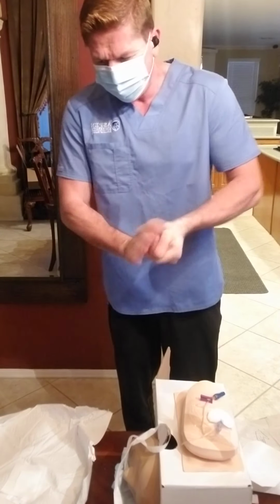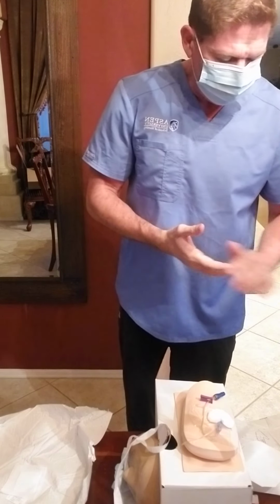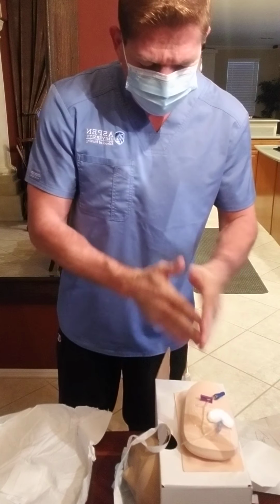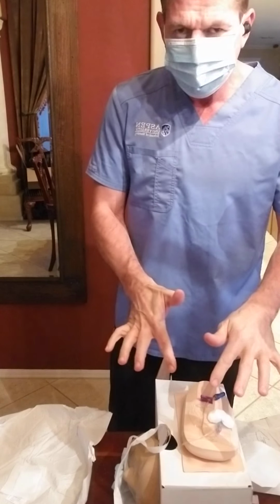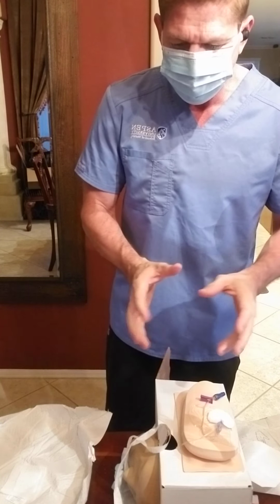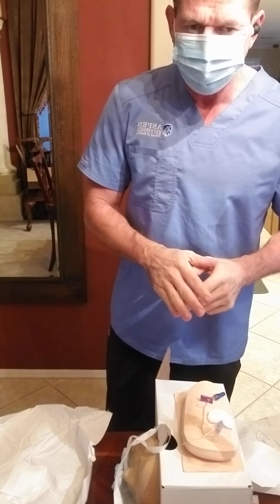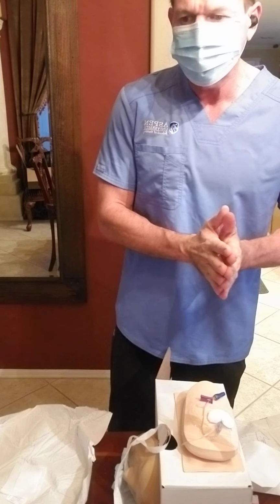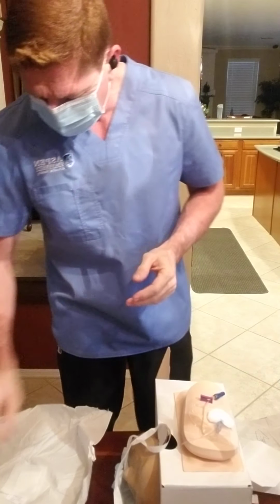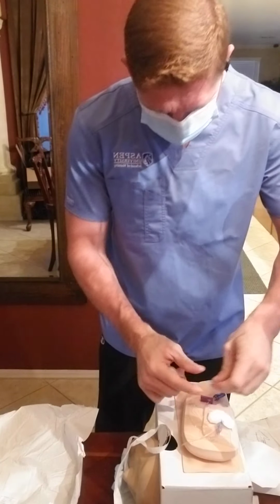I'm gonna go ahead and perform hand hygiene. Make sure everything that I use here goes into a bio bag. I also would have inspected as I was cleaning the incision for any swelling, any redness, any signs of infection, and I would have measured the tubing and compared it to the previous documentation to see if that tubing has migrated or moved at all. I would finish taping the line if needed, like so.